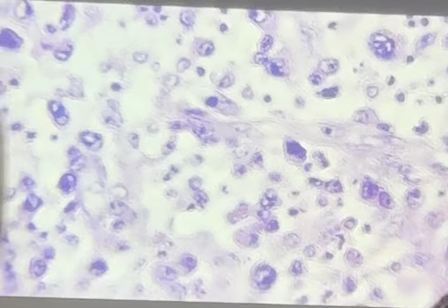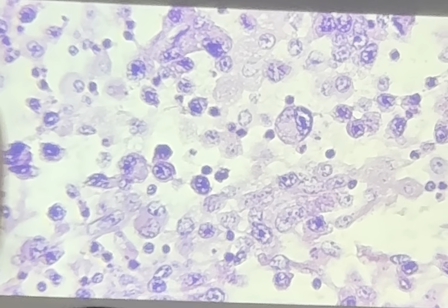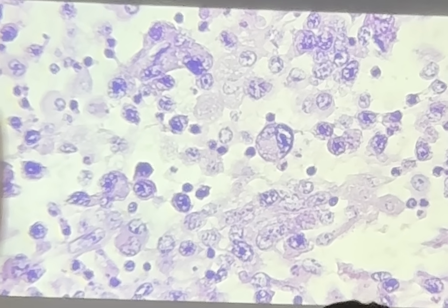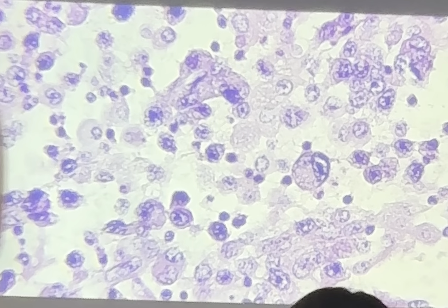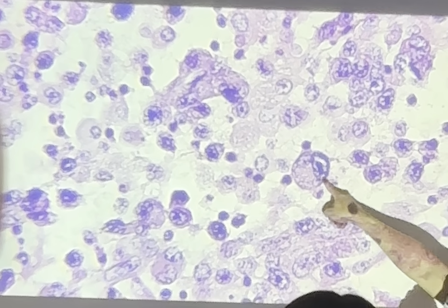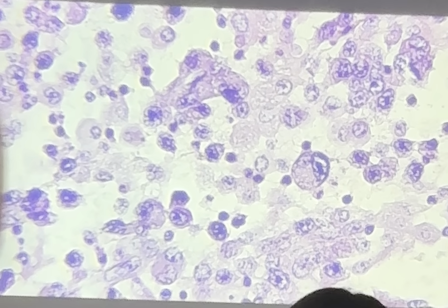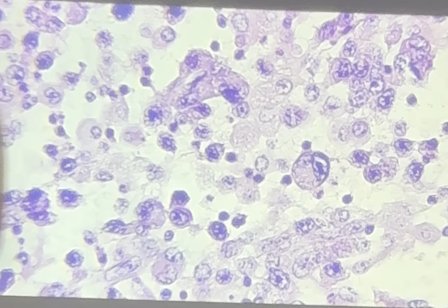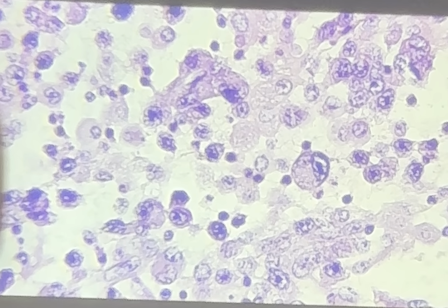Very high mortality rate. Look at the size of that cell here in the middle. See that cell? It even has a very weird nucleolus that's really elongated. There's really marked pleomorphism. We have this giant nucleus and a smaller nucleus, a very prominent nucleolus. Yeah, that's pretty ugly, and you can't even tell what this used to be. So this is one of the hallmarks of malignancy, anaplasia. The other hallmarks being invasion and metastasis.